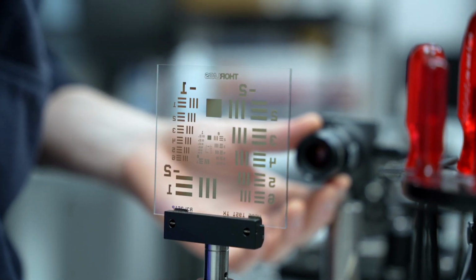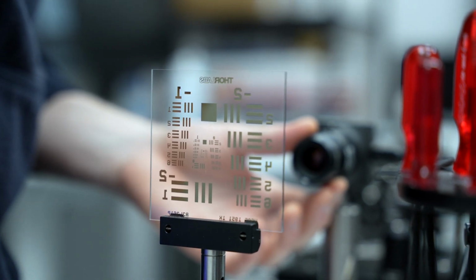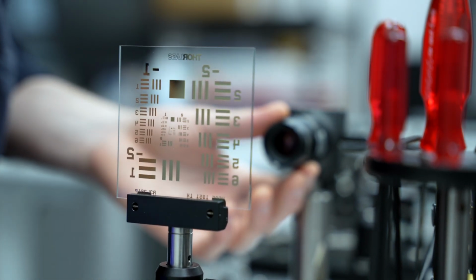lot less important. There's a temptation when picking a camera sensor to just pick the one with the best raw specs, but this can just drive up cost and potentially even require higher specs on other parts of the device if we actually want to take advantage of those specs. So the best approach really is to choose a camera that meets the requirements, but doesn't spend additional money on just specifications that don't actually lead to better effectiveness for the device.